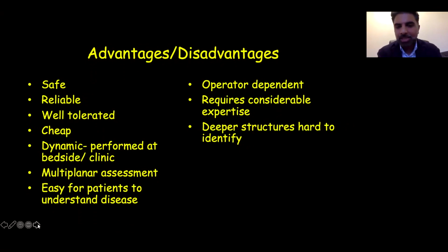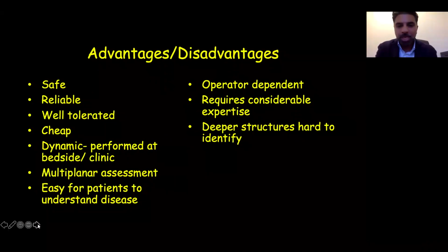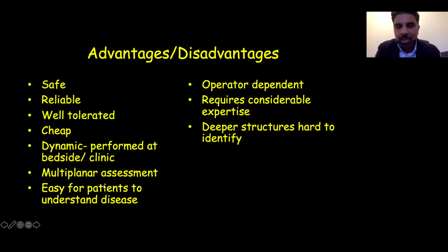At the same time, it's actually quite good for non-organic conditions as well. We see lots of non-inflammatory musculoskeletal conditions where people will have lots of issues with their joints, lots of pain, etc. But if we can show them that there's nothing wrong with their joints, that can again give them lots of reassurance, and then they can focus on what they need to do, whether that's pain management, physiotherapy, and things like that. The main disadvantages, and this is what I really stress, is that it is operator dependent, requires lots and lots of expertise.